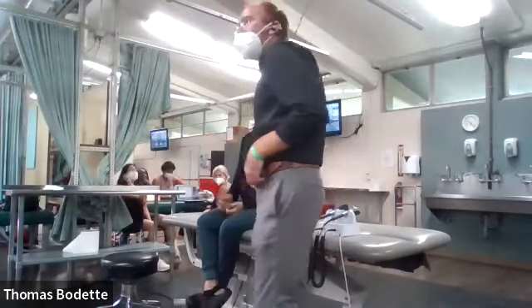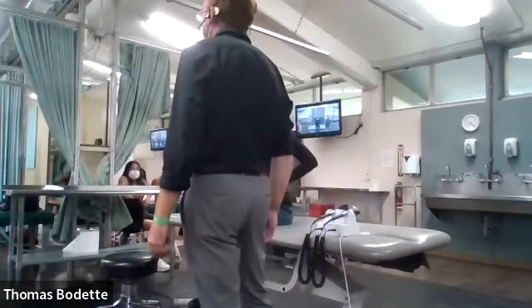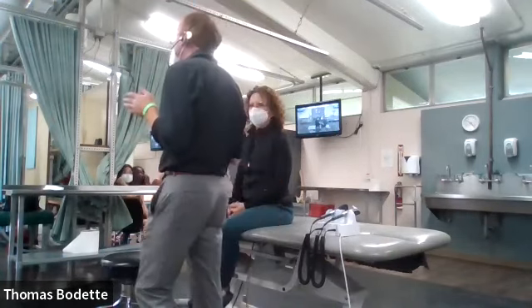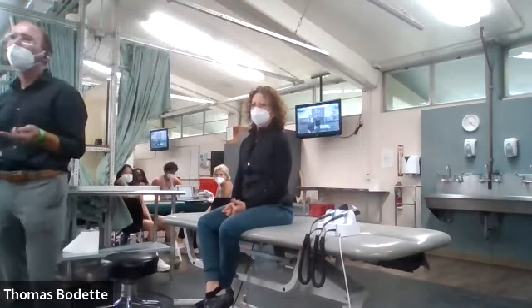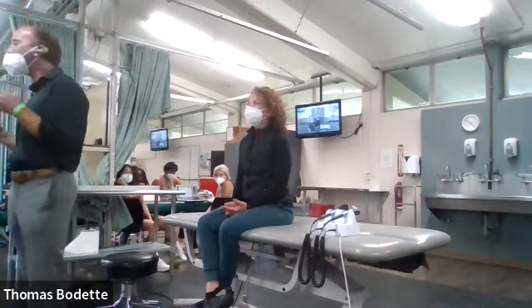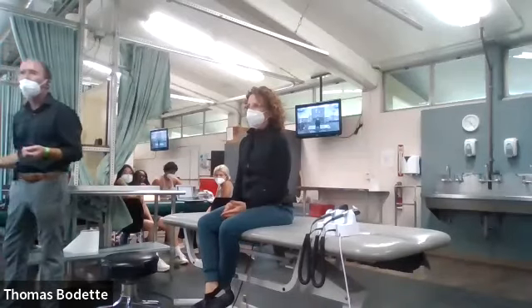All right, so as I've stated, ophthalmoscopy is arguably the most difficult thing that we're going to do this entire trimester. So if you're still a little frustrated, if you're still not really confident in your technique, if you still really haven't seen anything, don't be discouraged. This takes a lot of practice, and as I already mentioned, since we can't dilate the eyes in our scopes, it makes it that much more difficult.